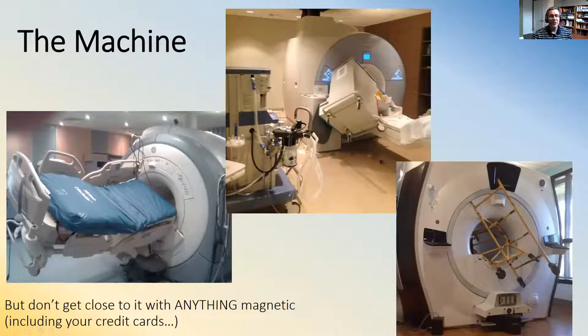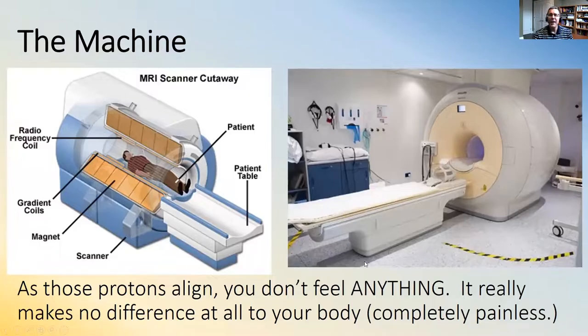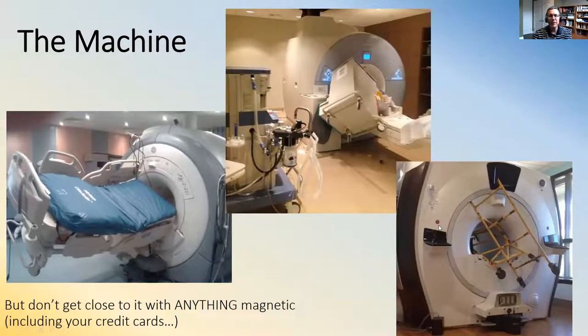So you might say, oh, Dr. Rehse, that strong magnetic field, that's really strong. Is that dangerous to anybody? Yeah, it is. Actually, if you look at this picture, you see this yellow caution tape on the floor? Yeah, and you can see that yellow caution tape over here too. That yellow caution tape is there for a reason. That magnetic field is so strong, you're safe going inside of it, but if anything metallic and magnetic comes into that room, big, big problem.